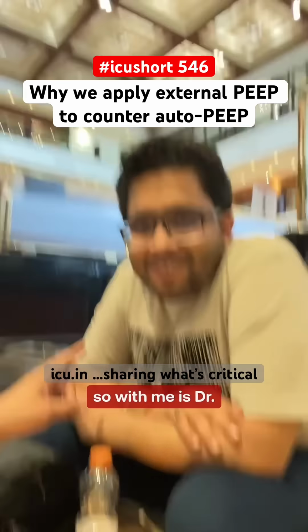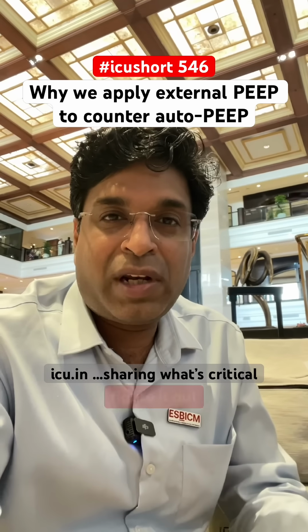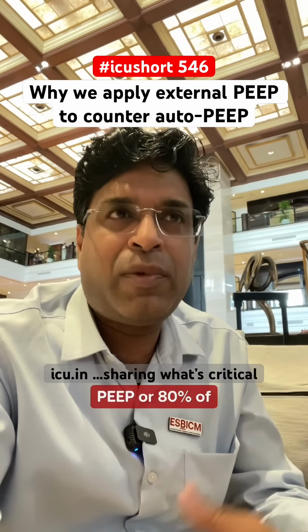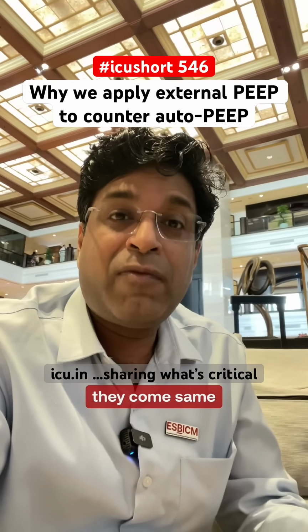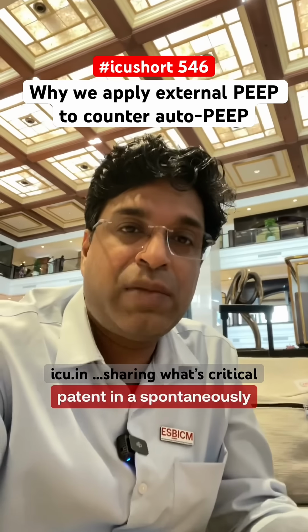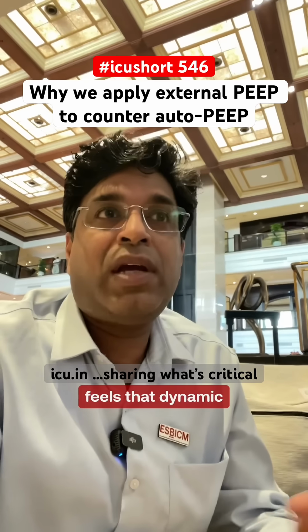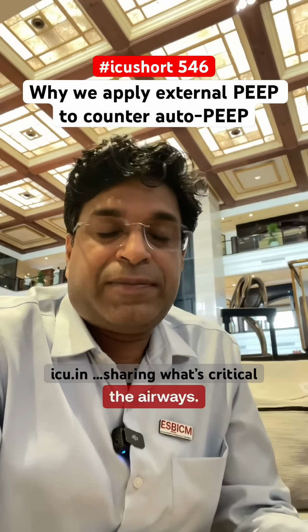Okay, so with me is Dr. Abhi, and he is asking that still he is not able to figure out or understand why we apply 80% of the total PEEP or 80% of the auto PEEP, more or less they come same. Why do we apply it in COPD patients to keep the airway patent in a spontaneously breathing patient? Because with the application of PEEP, he feels that dynamic hyperinflation will worsen and it will compromise the airways.